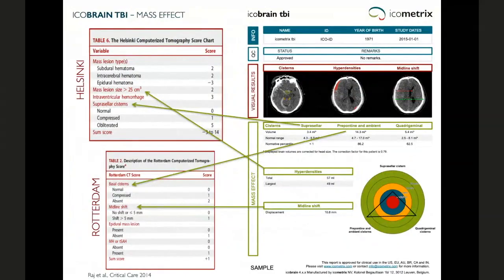This report actually reflects the variables that are also included in current CT scoring systems, like the Rotterdam scoring, Helsinki, and the NIRIS scoring. So with our reports, we really provide a way to easily integrate such scoring systems in your clinical practice.